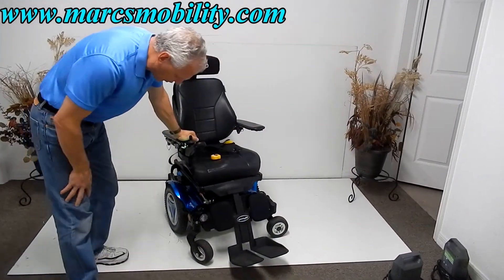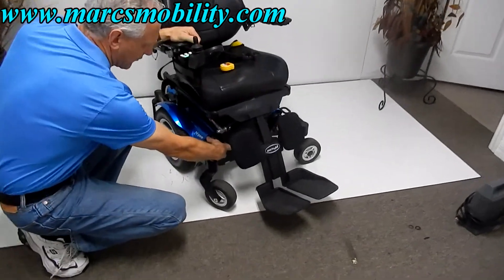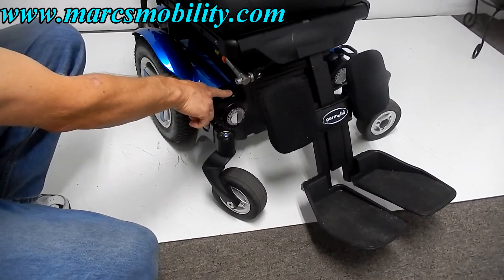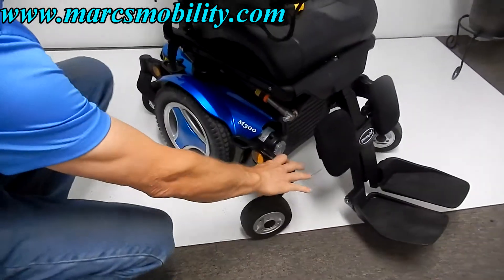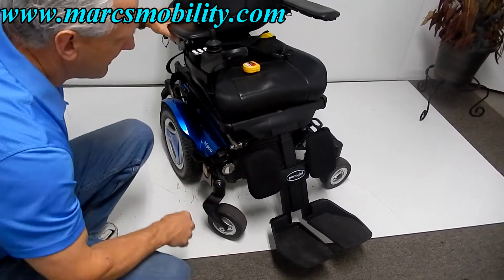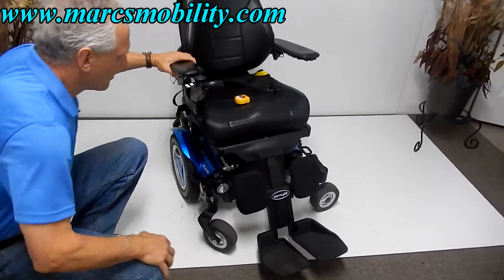If you ever need to put this chair in neutral, you have levers at the front of the motors. On each motor you have a lever. Turn the power off on your chair, push the lever towards you, and then your wheel is unlocked. You need to do both motors. Put it back, turn your power back on, and your power is restored.